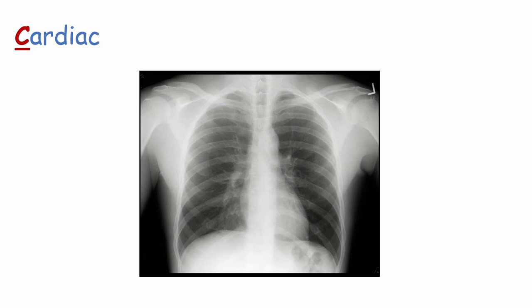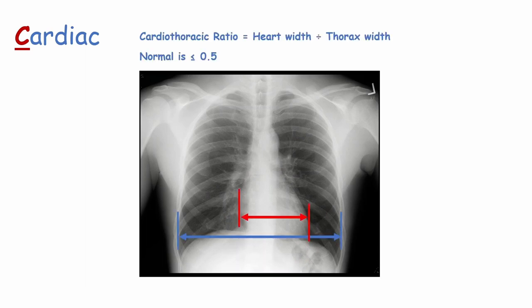Cardiac refers to the heart. We should check that the heart borders are clearly visible, as they can be obscured by underlying lung pathology such as consolidation, a tumour, or pulmonary oedema. The aortic knuckle should also be clear and not enlarged — an enlarged aortic knuckle could represent an aortic dissection, which would be a surgical emergency. We then need to check the heart size by measuring the cardiothoracic ratio: we divide the heart width by the thorax width. If this is over 0.5 on a PA film, the patient has cardiomegaly.